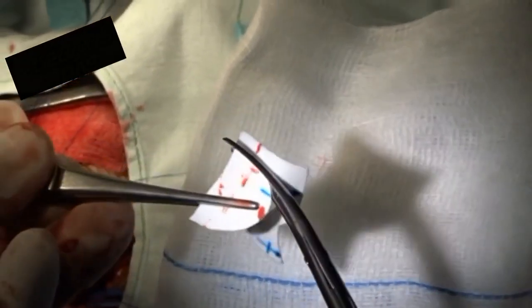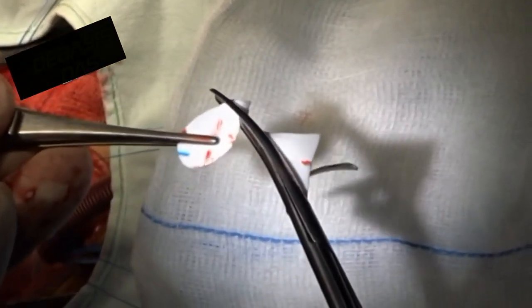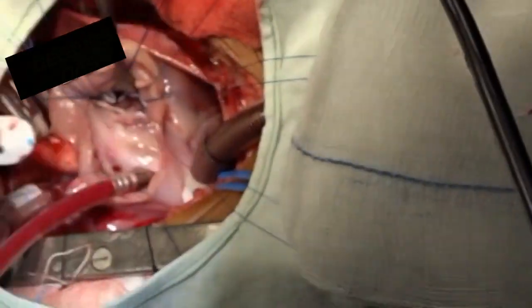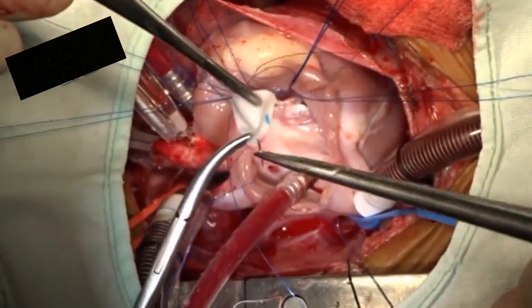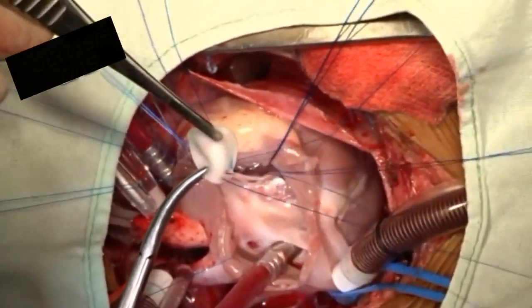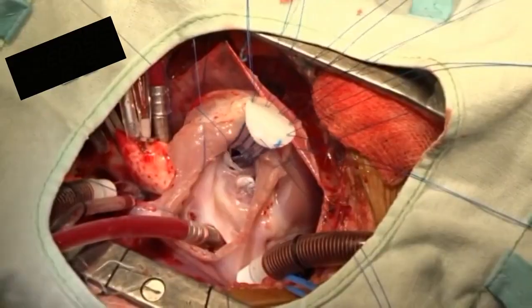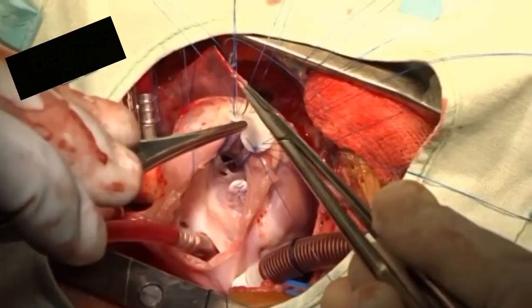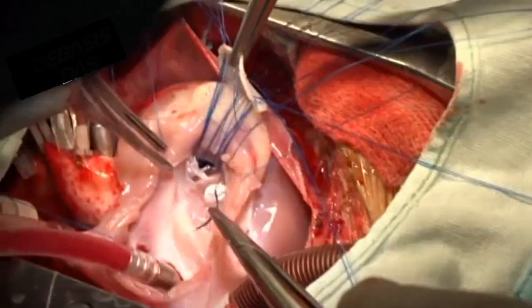An appropriately sized VSD patch is then fashioned. As I said, the VSD in tetralogy is a large unrestricted VSD, and the diameter of the patch roughly corresponds to the diameter of the ascending aorta. The VSD sutures are then sequentially passed through the VSD patch in an equidistant fashion. All the sutures have now been passed, barring the tricuspid inlet portion.